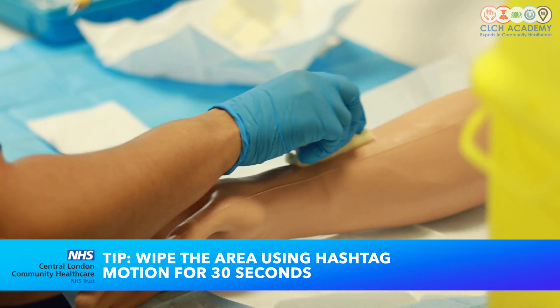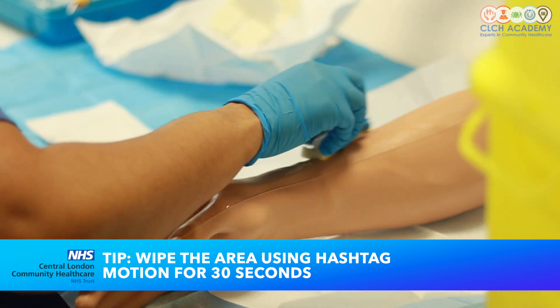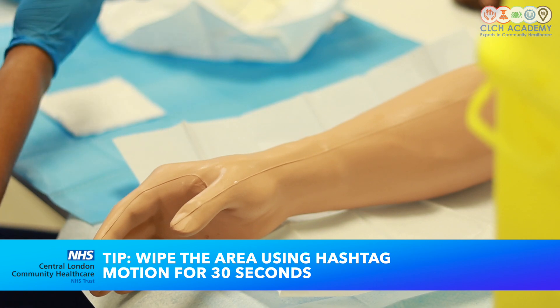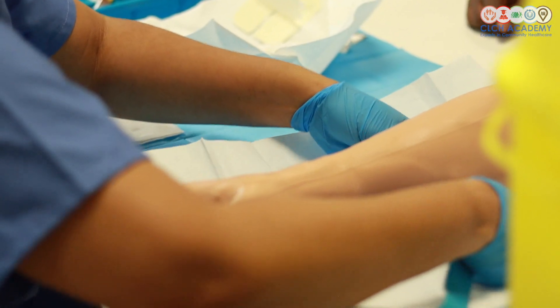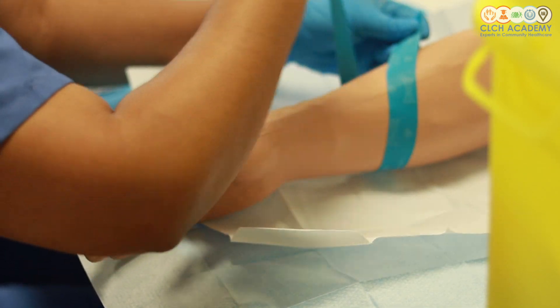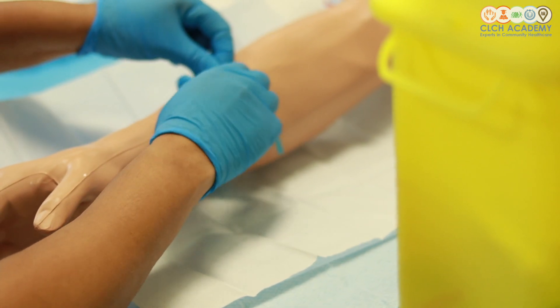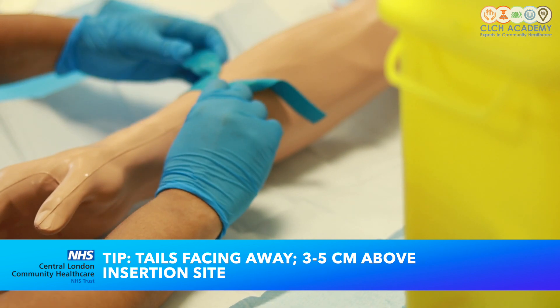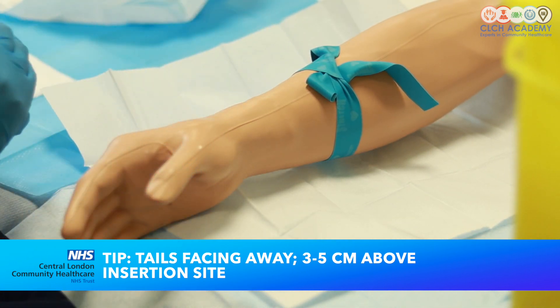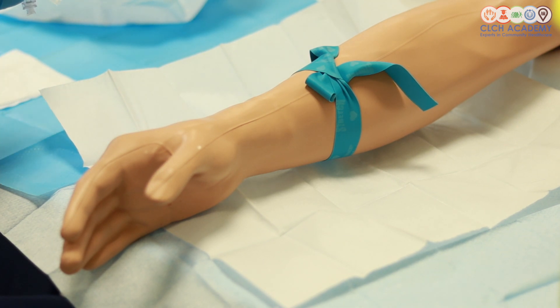Up and down, then across — 30 seconds is what you're aiming for. Once that's cleaned and I'm waiting for that to dry, the next step I'm going to do is apply my tourniquet. Create an X with the long side overlapping the short side, make a loop — pull the long end through to make a small loop as you pull on the short end — and that should ensure that your cannula is secure, tails facing away from the area where you've cleaned, and about three to five centimetres above your point of insertion.